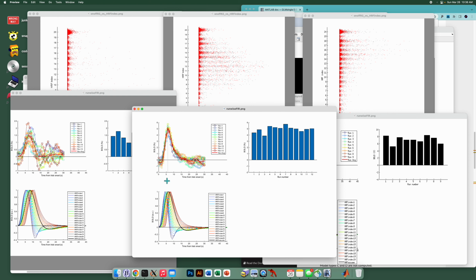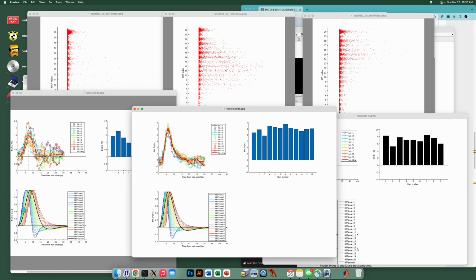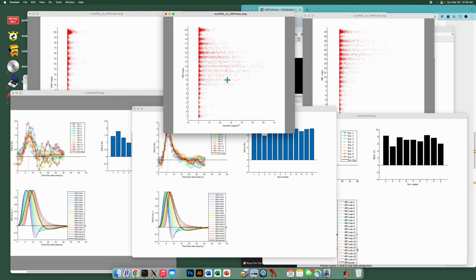So the peaks as determined at this time point, I guess that's 6 seconds after trial onset, which is the peak of the run average, which is shown in red, as we mentioned. Anyway, the amplitudes are highly consistent. So that's good. And we can also visually compare against the library. Notice the library looks a little different, and this is because the stimulus duration in this experiment was longer than the one in here. But we can now visually compare across these two plots, and it should be the case that it matches what we see here.